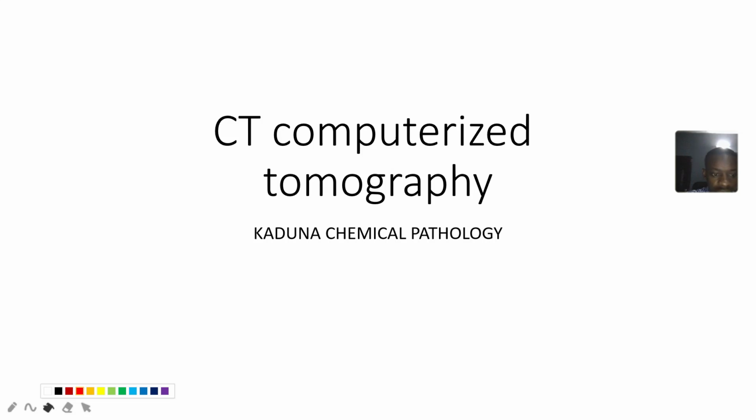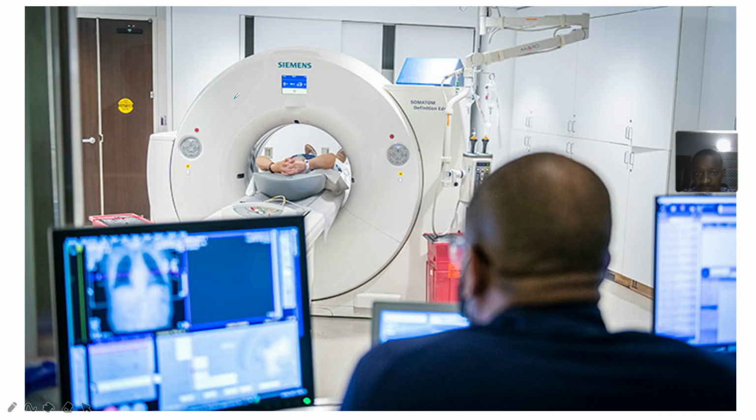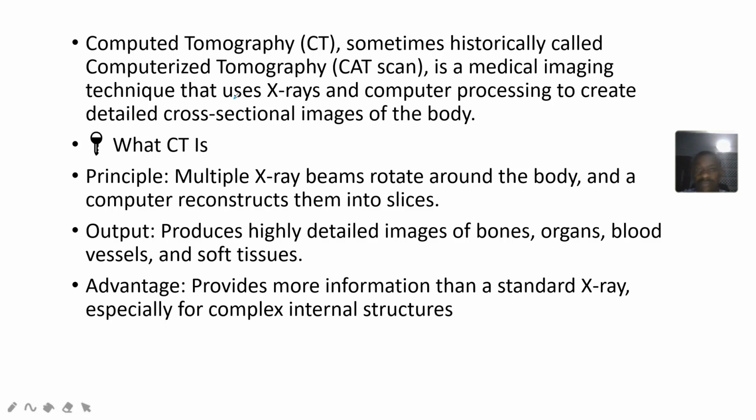We'll quickly try to look at computerized tomography, a CT scan, okay? It's just a modality that we use in the radiology department to basically get images of the inside of the body. So if somebody has an internal issue, there's no point tearing this person open before you see what is wrong, okay? You can just do a CT scan.